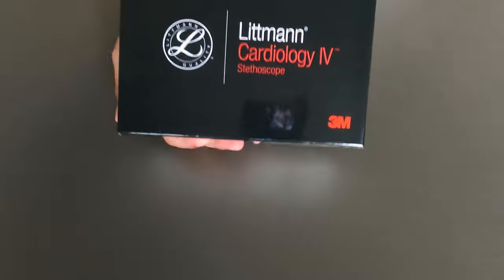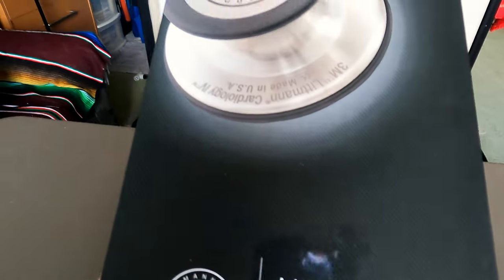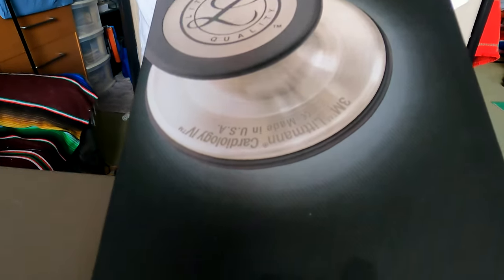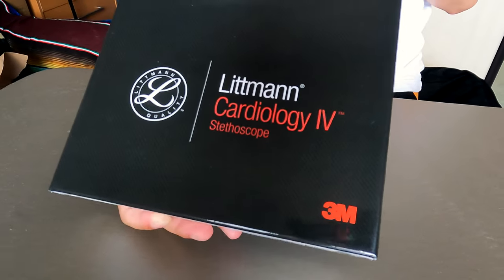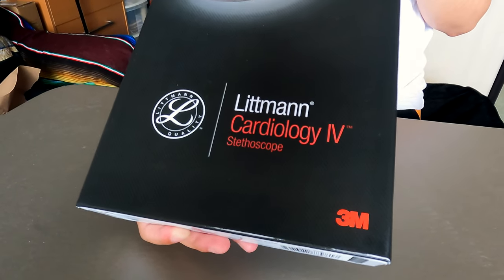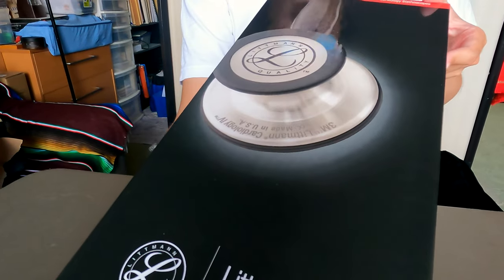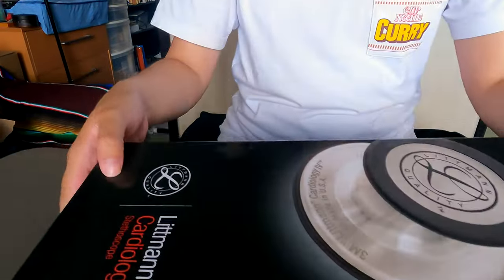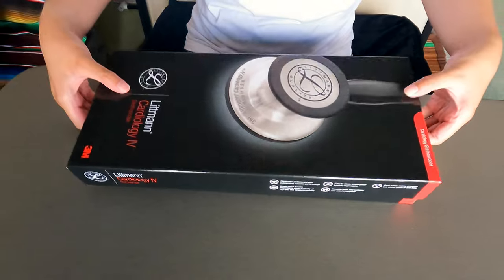This is an amazing glossy box that my stethoscope came in. I actually got the Littmann Cardiology 4 version, which was the one recommended by the Medical Students Association at the university I'll be attending. Without any further delay, let's open up and see what's inside this lovely looking box.